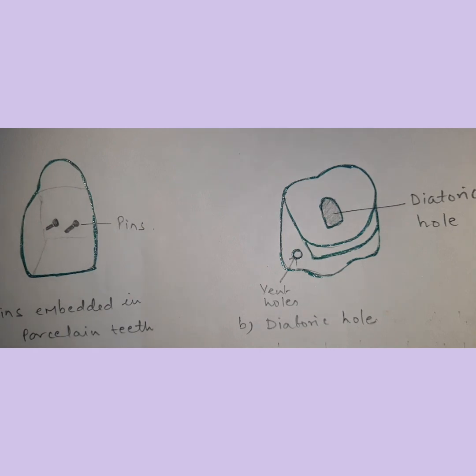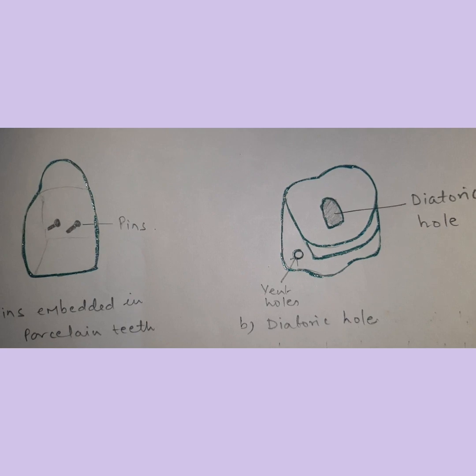But one advantage of porcelain teeth is, of course, better aesthetics. Also, they are the only type of denture teeth which allows the denture to be rebased, because they can maintain their shape and size for years. Another drawback is that they abrade the opposing natural teeth, because they have greater wear resistance, and materials such as gold crowns also suffer abrasion of the opposing restorative material.